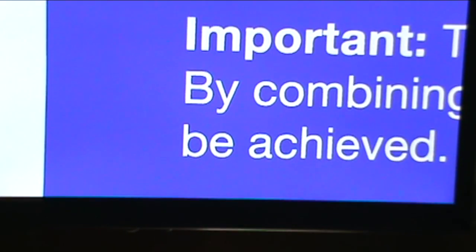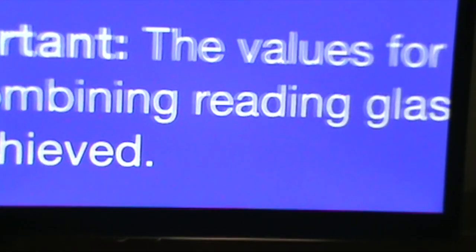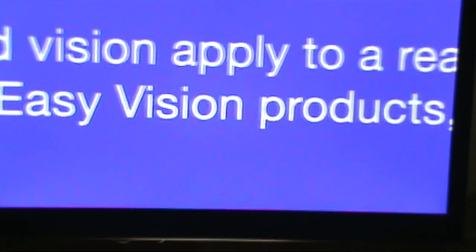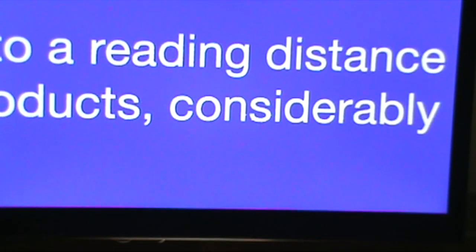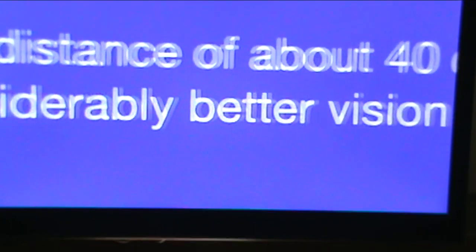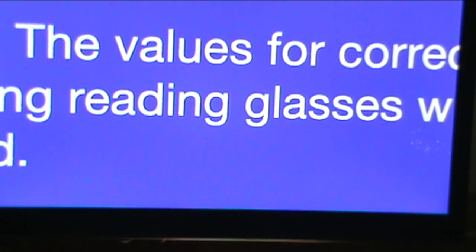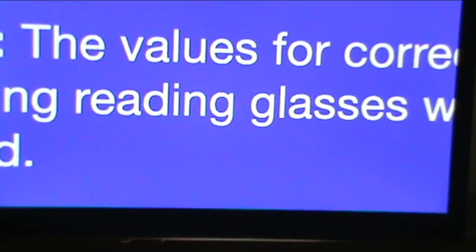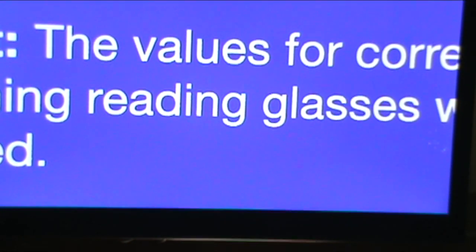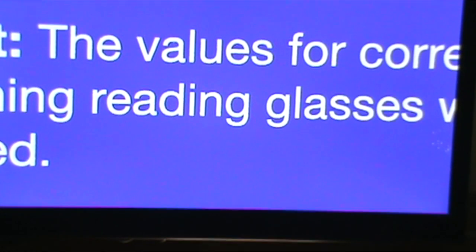And that's a nice feature also, because sometimes as we're scanning across, we want to be able to scan easily without it either climbing or going downhill, if you will. So that's another feature that we want to be able to do. And this one makes it very easy to do. There's many video magnifiers out there on the market that don't have a guide, either above the XY table or below the XY table. It's something you want to look for in a video magnification system.